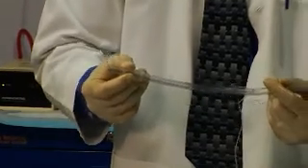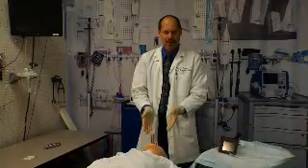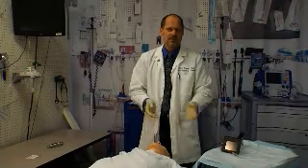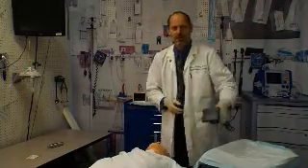Next, load your endotracheal tube on your airway rifle and place your supraglottic device in the usual fashion. Once your supraglottic device is correctly placed and your patient is ventilated, you can easily transition this to an endotracheal tube using the video rifle.